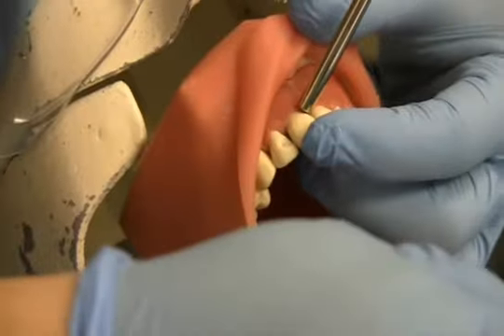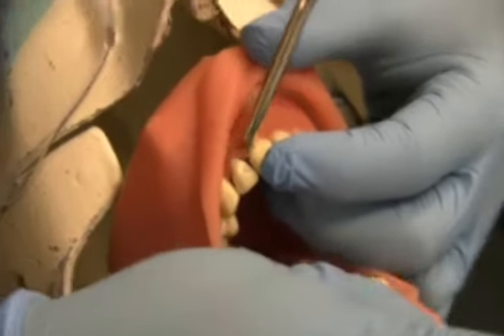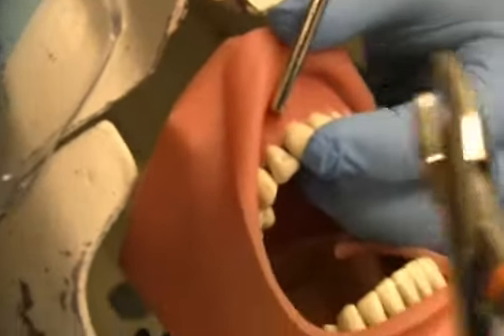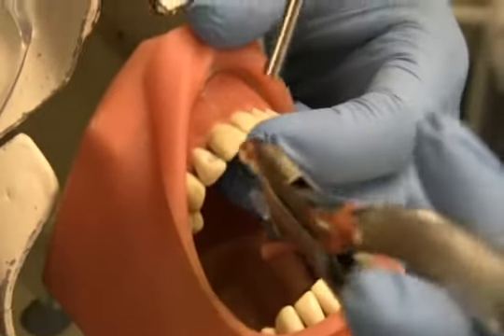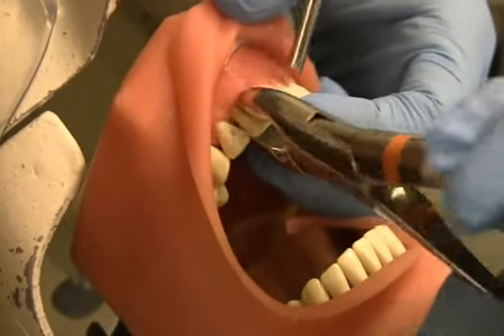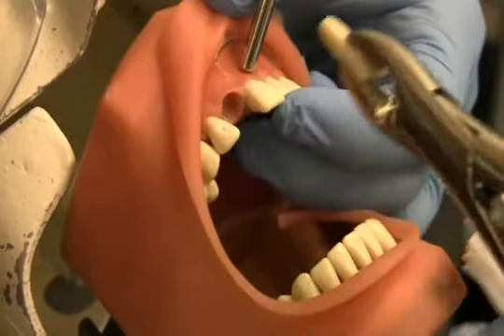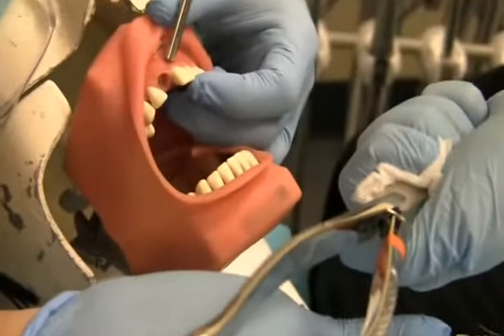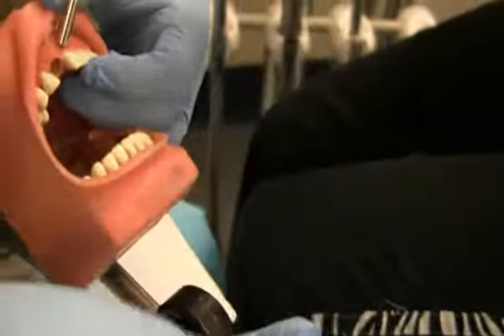Notice that the dental assistant continues to suction the entire time. We would pass the dentist the anterior forceps. The dentist would then take the forceps and remove the tooth. The dental assistant will have gauze ready in her hand and take the entire tooth and forceps in one movement.